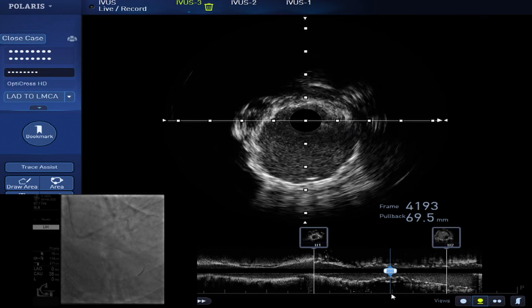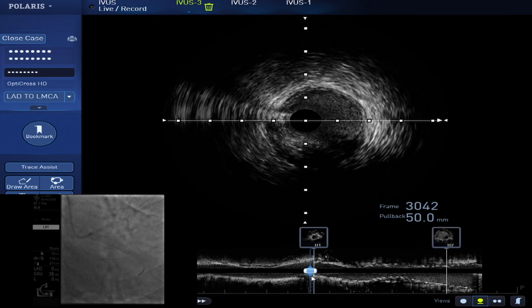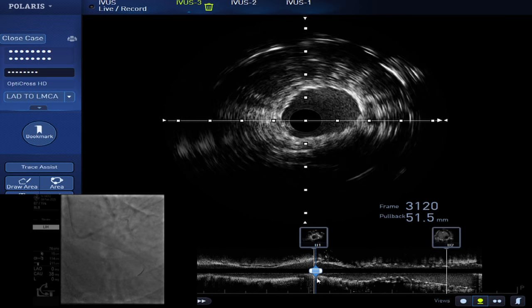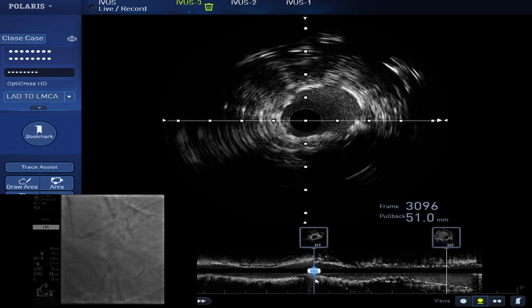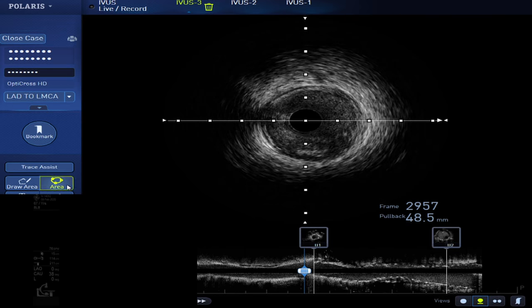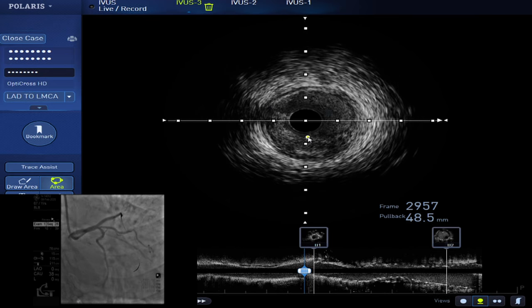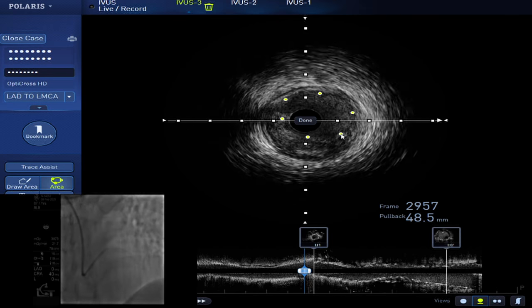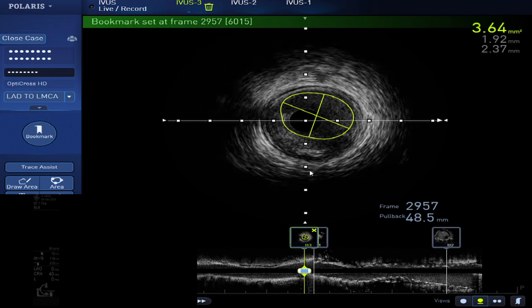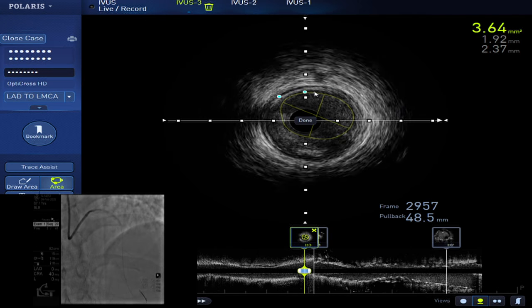Right there in the distal edge of the stent, it's a little bit smaller compared with the proximal. But try to check the far distal from the stent edge, right? A little bit, yeah. Epicardial, okay. Same. But the size is... This one first. Around 2, right? Epicardial. Looks nice. Looks pretty good.